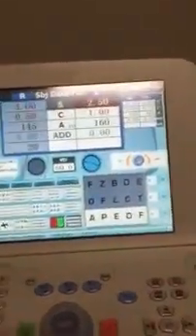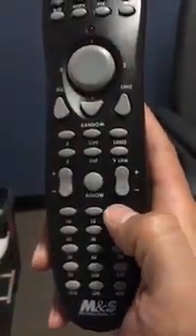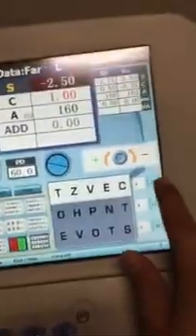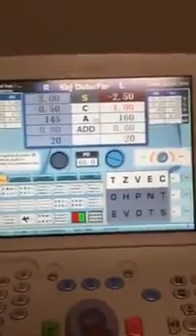And then I would go down, because I'm gonna try the 20/20 line. I will change the letters as well. I'll press the 20 button, change those letters, and if they can read those letters, great, then I'll put that their VA is 20/20. Now the left eye is done.